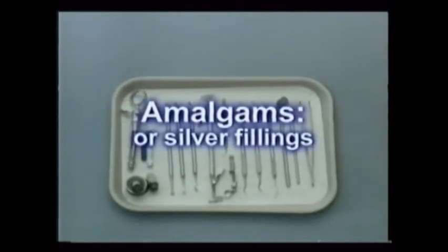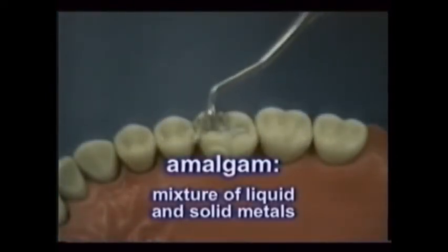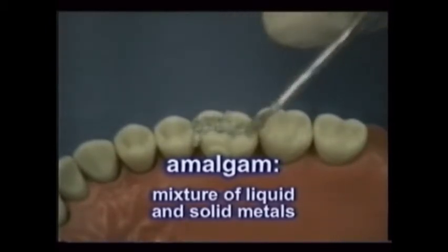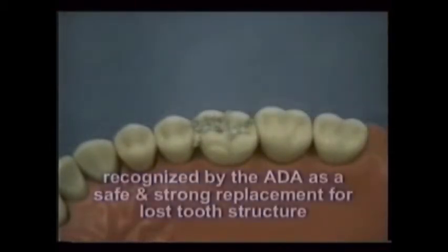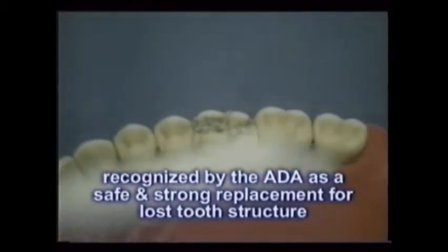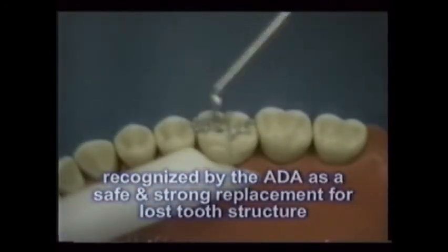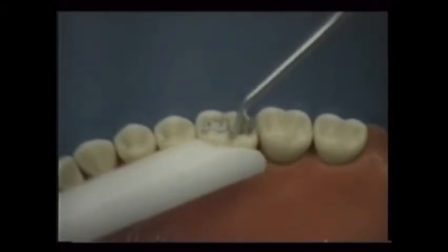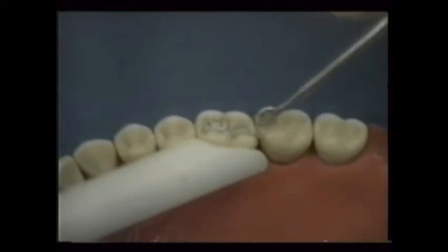Your practice may offer patients amalgam fillings. An amalgam is a mixture of mercury, a liquid metal, and various other metals in solid states. Once fully set, the filling is inert and offers a safe and extremely strong replacement for the lost tooth structure. Some practices have moved completely away from using amalgams. If yours has, you may want to fast forward to the next section on composites.